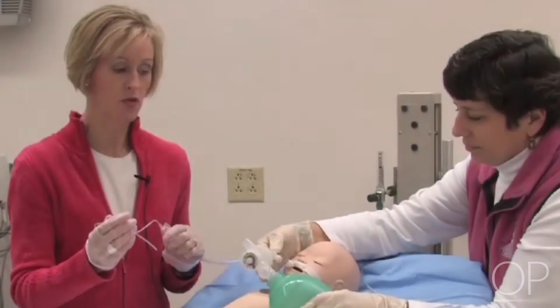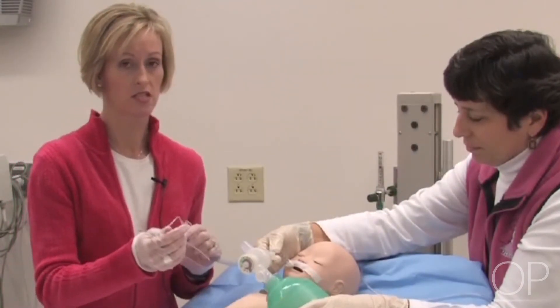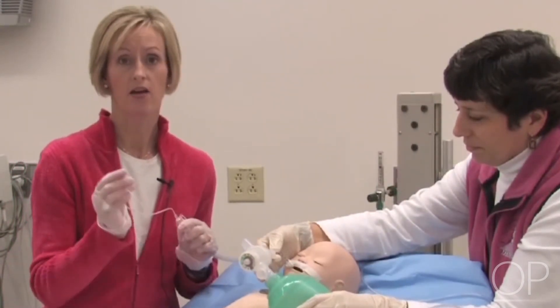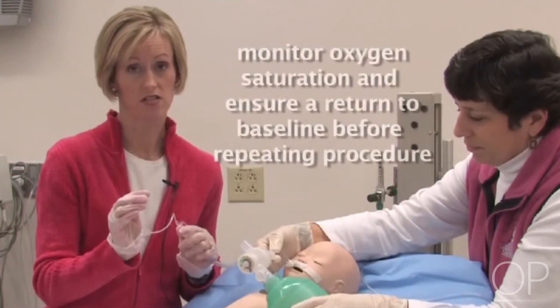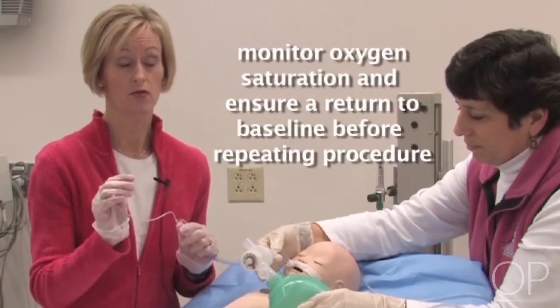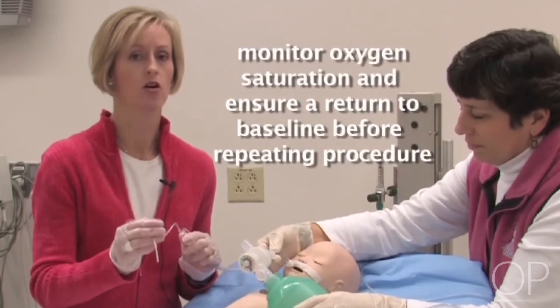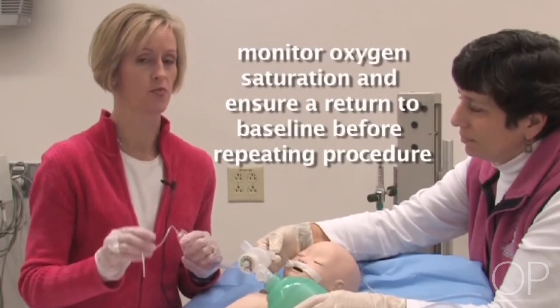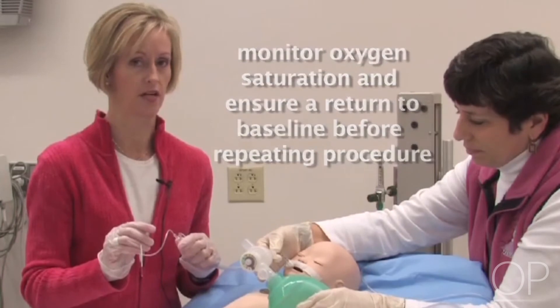In between passes, we'll continue to hyperoxygenate and watch our oxygen saturation, making sure they're either remaining at baseline or come back to baseline prior to passing the catheter again.